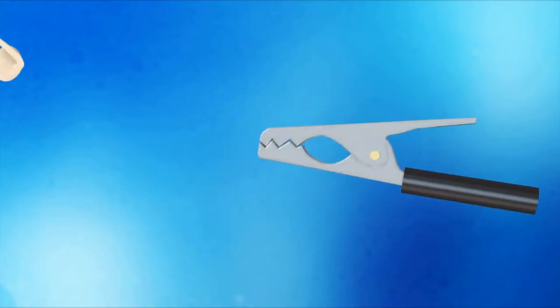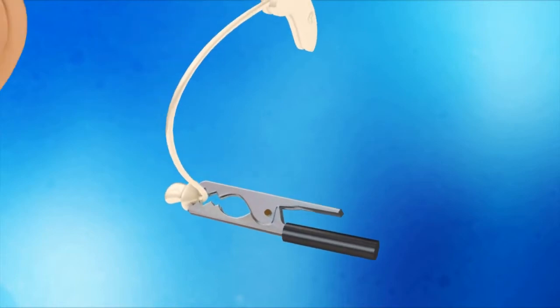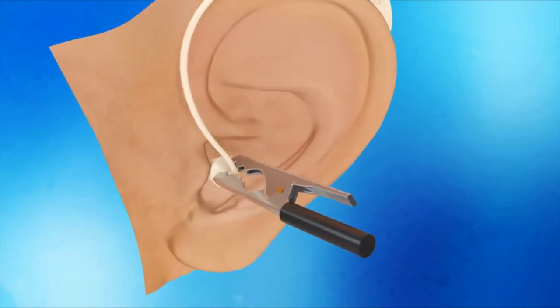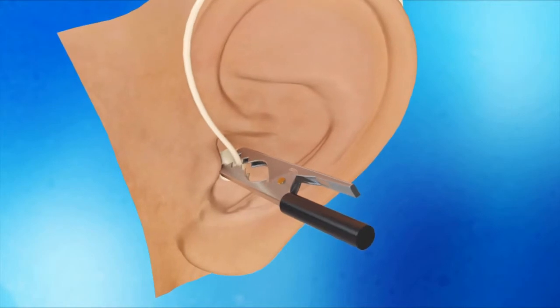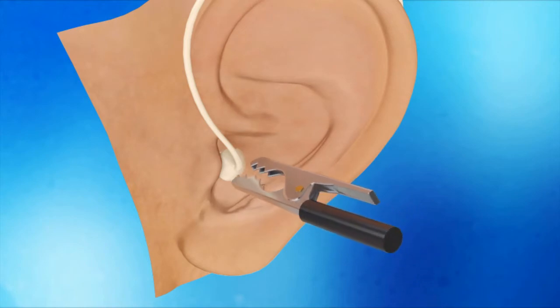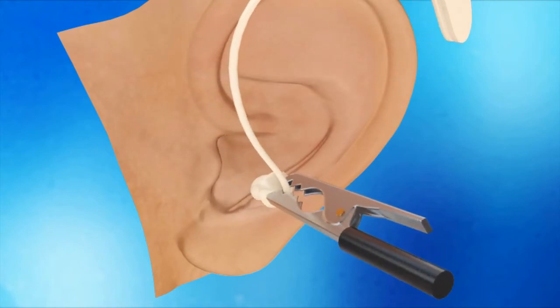To use the invention, one simply places the transducer in the clip, then uses the invention to easily insert the transducer within the ear canal. Once properly positioned, the clip is gently squeezed and the invention removed. This process works in reverse for easy removal as well.